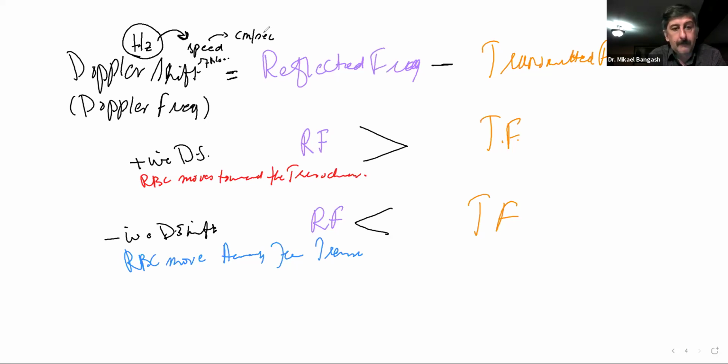But the only thing that the system primarily gets is the frequency reflecting back from the red blood cells, which may be constantly increasing, or which is going to be greater than the frequency at which the system was transmitting.